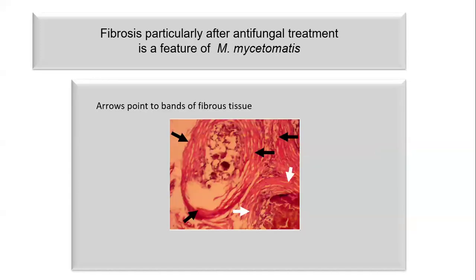What happens after you give antifungal treatment? You will appreciate where the arrows are. This is fibrosis. Okay, so there is a lot of fibrosis. So fibrosis after antifungal treatment is also a feature of M. mycetomatis.